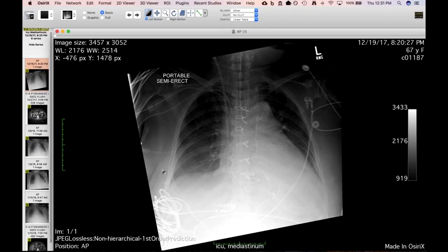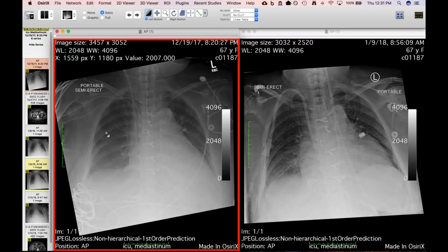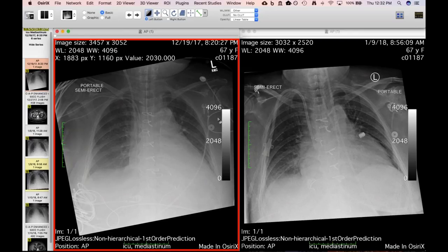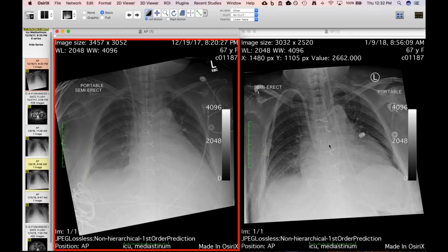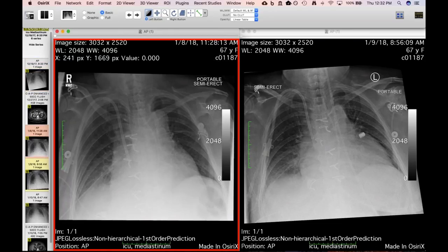A few weeks later, she had a large-bore dialysis catheter placed for acute renal insufficiency. I always look at the lungs last on ICU radiographs. One sternal wire looked displaced — way out of line. There was discussion about whether this was significant.